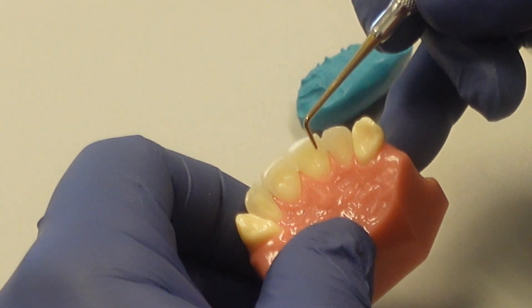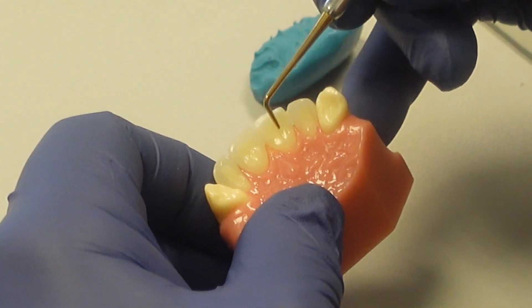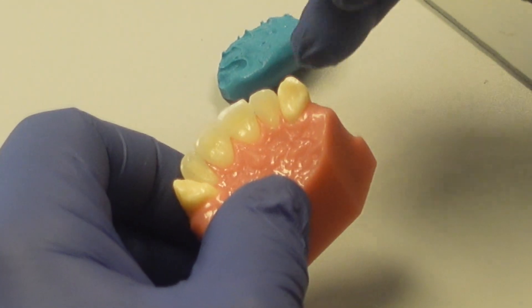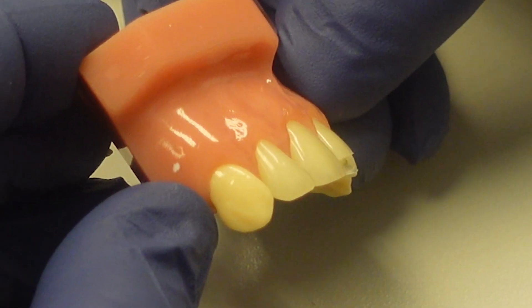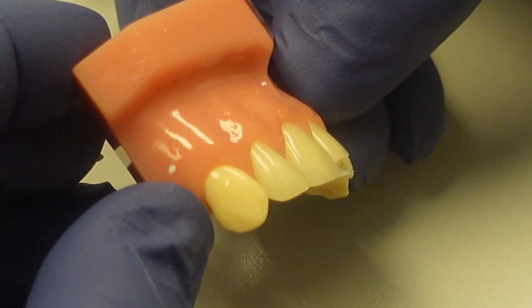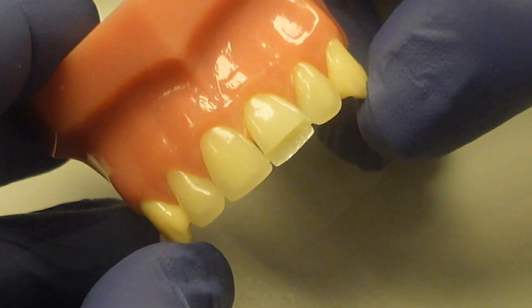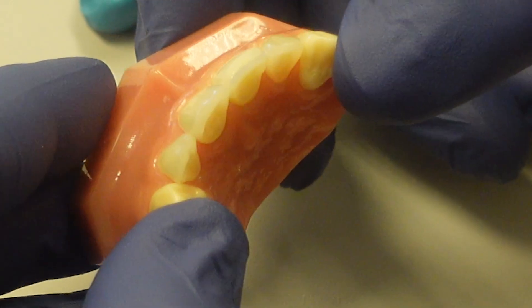The first thing I like to do when I take the template away is to check the lingual, just to be sure that it's set. Because sometimes this area doesn't set, and when I take the template off, the uncured material will lift away. So I'd want to blend that in before I cure the lingual. The cross-section looks like the letter L, where the composite is — so I've got plenty of room to add my other layers for the incisal translucency, lobe formation, and color blending. I'm fully formed on the lingual and on the incisal.